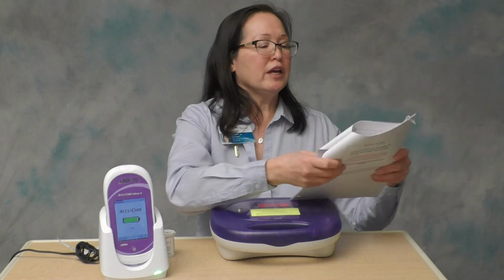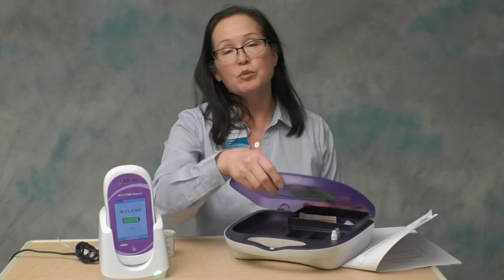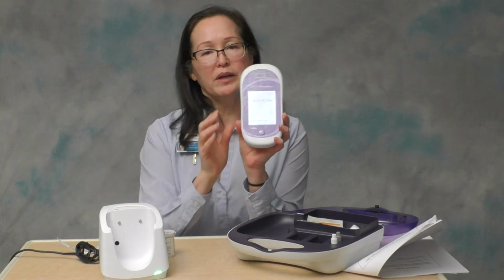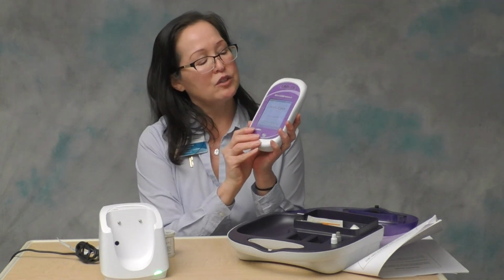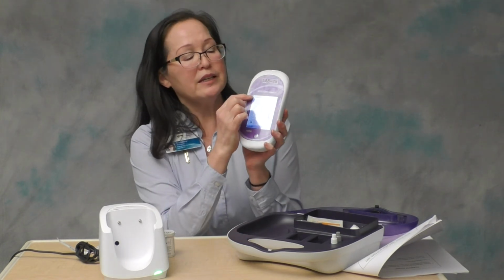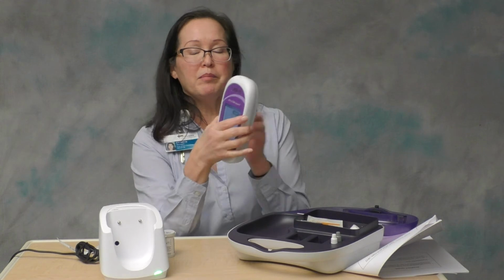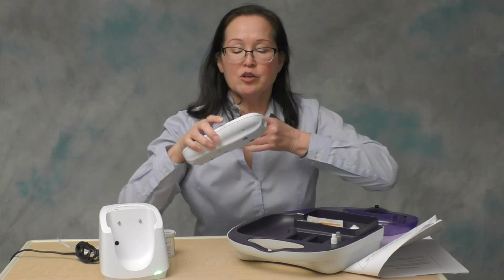So I'm going to demonstrate running the quality control solutions for you. And then this will be a part of your direct observation that we'll do at a later date. So to run QC solution, you're going to turn the instrument on by hitting that on-off button. It's going to go through a couple of windows, and then it's going to ask you for your operator ID. The way that it asks you for your operator ID is this little black tab says operator ID, and you see the scan button there. You can also manually enter it. So I'm going to scan my badge. Tap that scan button and scan your badge.